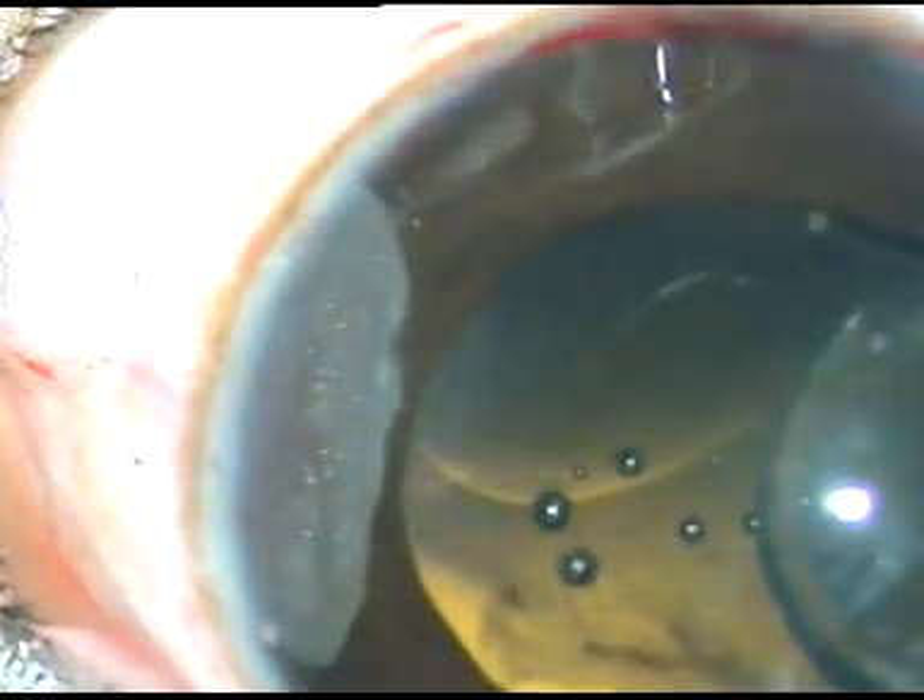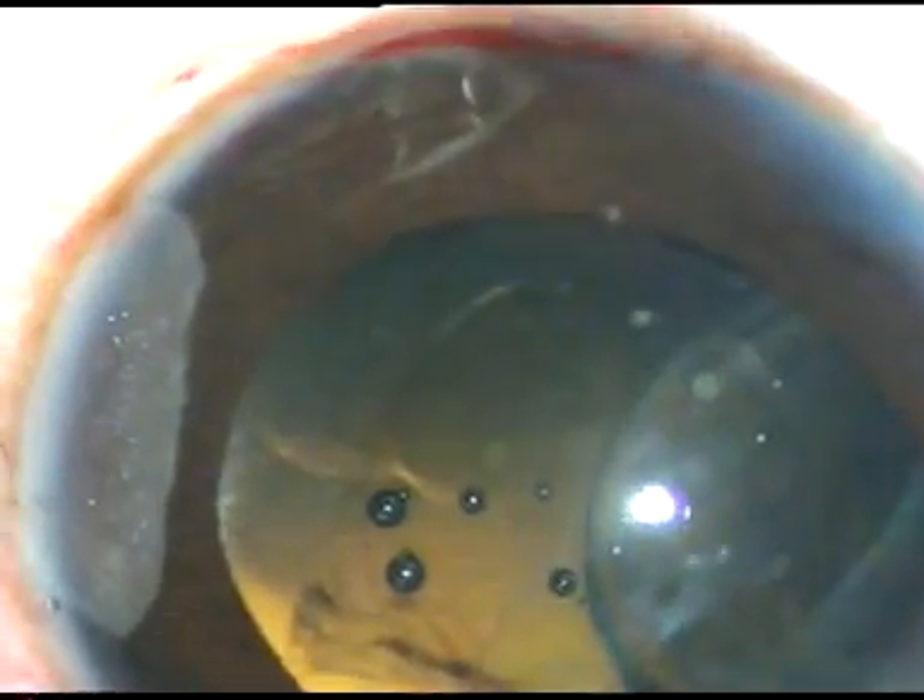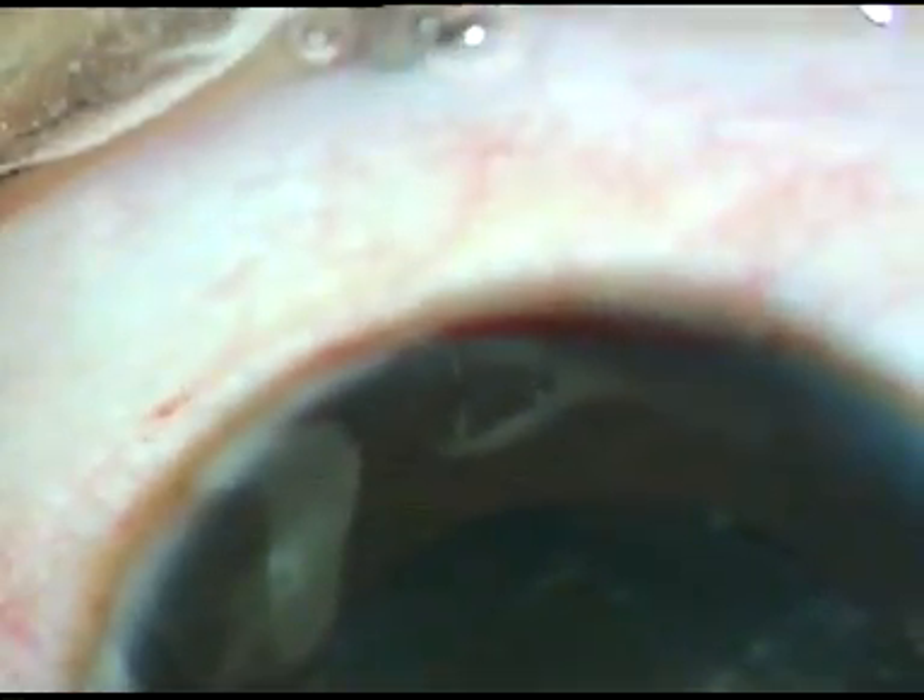I have gone inside the anterior chamber with the cartridge. Now the leading haptic is placed over the anterior capsular rim and beneath the iris, and very gently it is injected into the anterior chamber. Some more viscoelastic substance is injected over the optic of the intraocular lens. Then Macpherson's forceps is taken to hold the trailing haptic, and very gently I place the trailing haptic in the sulcus, between the anterior capsular rim and the iris.